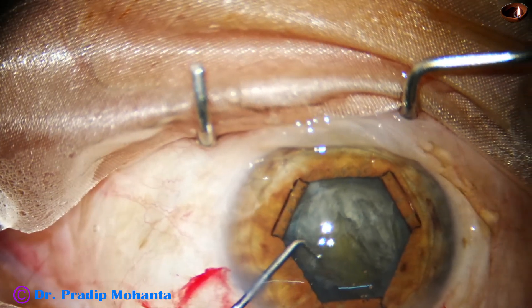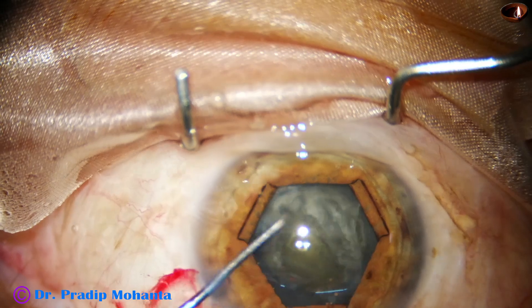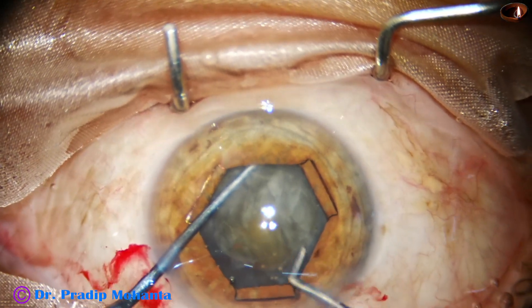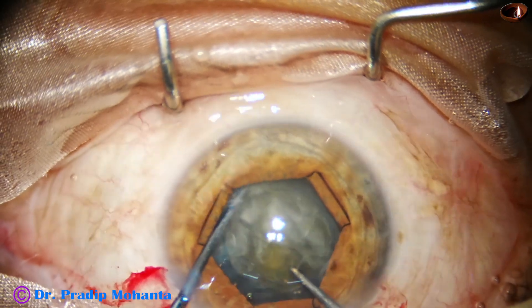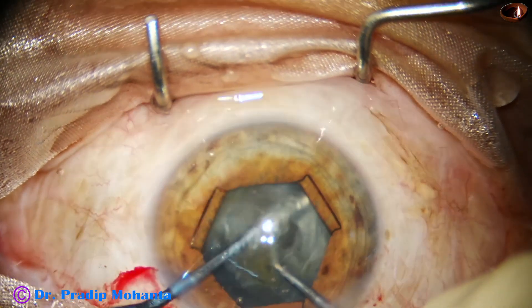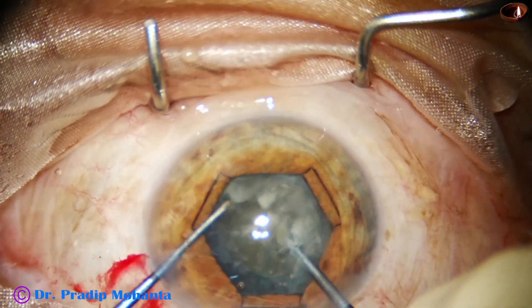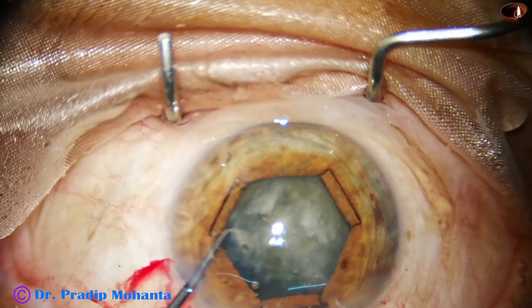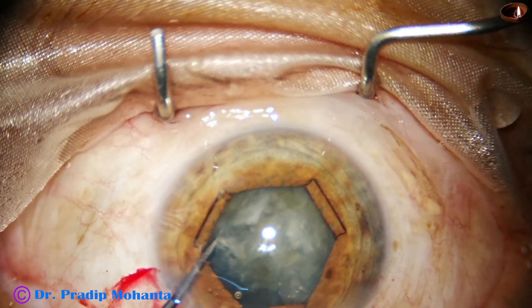I take the nucleus sustainer and pre-chopper designed by me, and divide the nucleus into 2 hemi-nuclei. Rotate, and then I cut one hemi-nucleus into 2, and I come out of the anterior chamber.